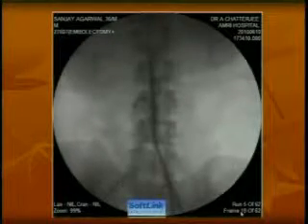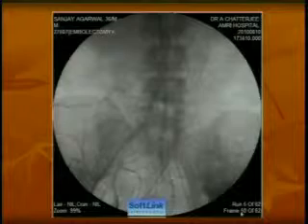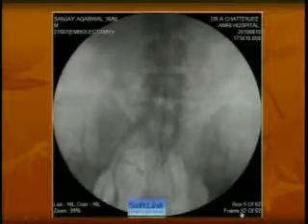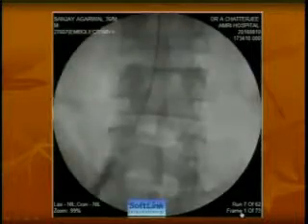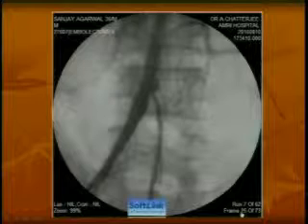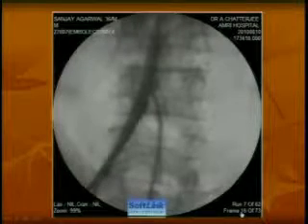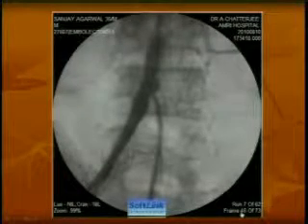So this is the first slide. As you can see, there is nothing. The wire has almost gone through the subintimal plane, just hasn't come back as yet. I had taken a radial route to confirm, and this is another shot from the iliac. There was a collateral which had become blocked, just distal to the bifurcation, which was blocked previously. Now there is flow in it.